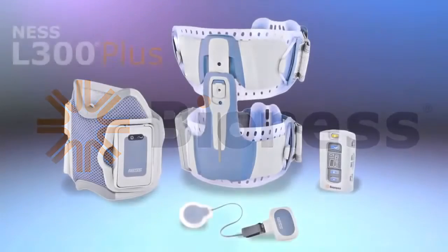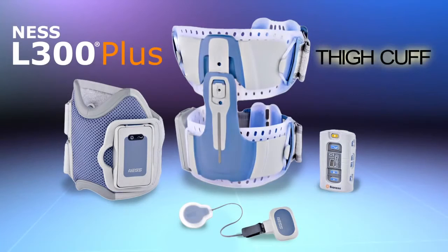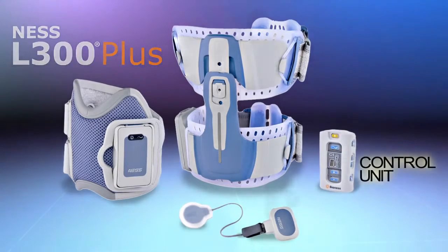The Ness L300 Plus system consists of four main components: a thigh cuff that fits above the knee on the quads or hamstrings, a lightweight cuff that fits below the knee, a small gait sensor placed in the shoe, and a wireless control unit.